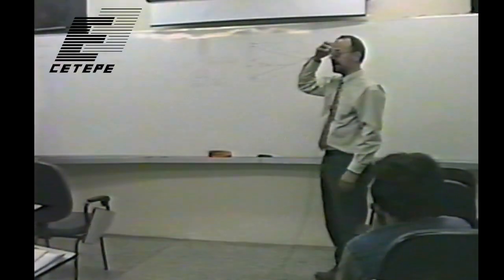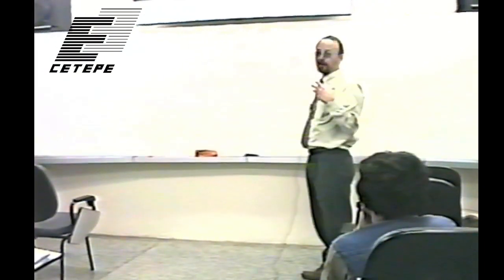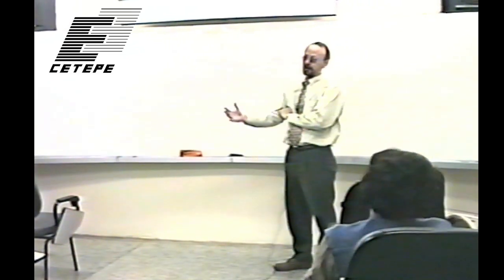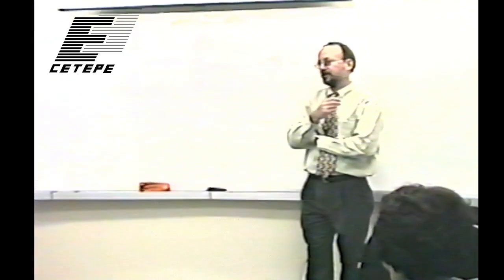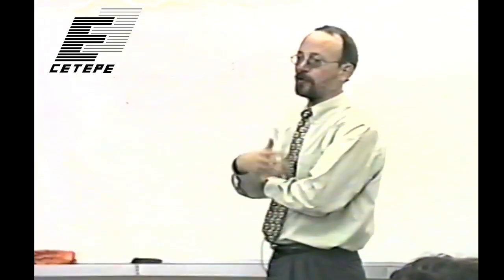Where we left off yesterday, I was just going to say a little bit more about detectors other than film. As I mentioned, there's a big motivation now because of the speed of computers and the need to distribute images widely, especially from rural areas, for instance, to major centers where there's experts to interpret the images. There's a big motivation to develop digital means instead of film. Not to mention the fact that once you have a digital image, there's much more you can do with it in terms of enhancing the contrast and automatic or computerized classification of features and so forth.